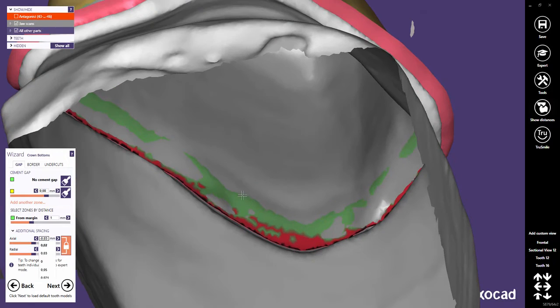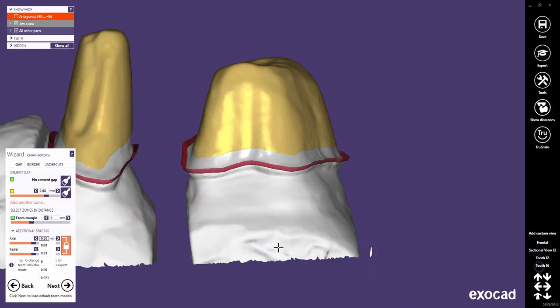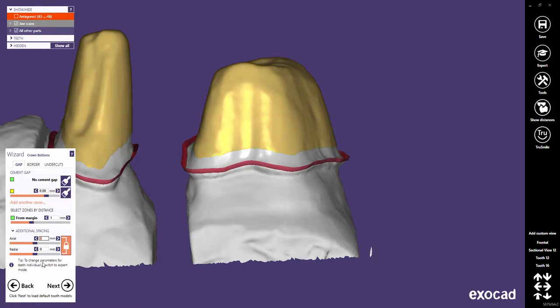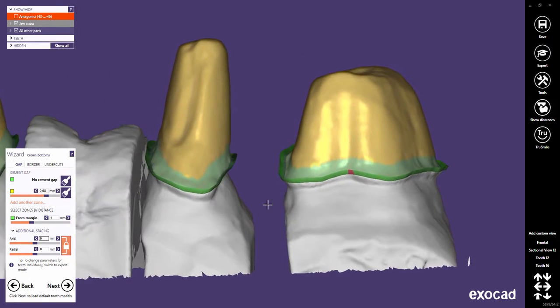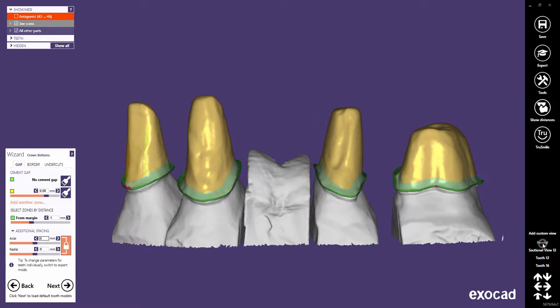However, trying to improve the fitting by changing the additional spacing values is a workaround, not a solution. A properly tuned CAM system should be able to achieve good fittings with minimal additional spacing.